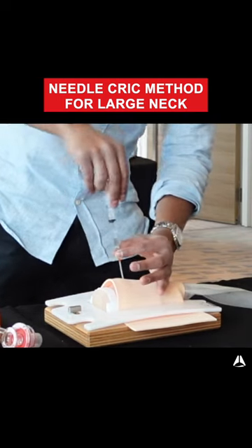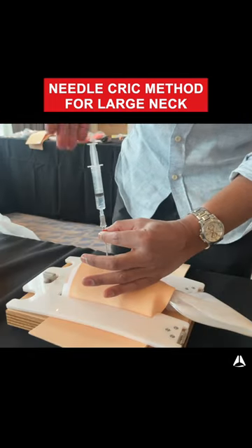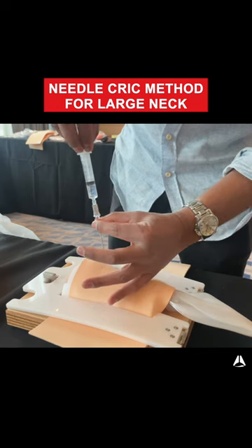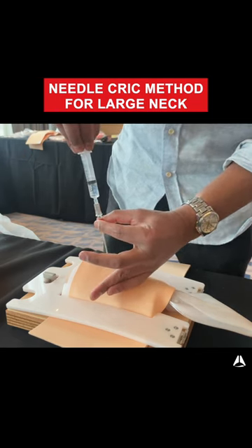Note that I'm not angling the needle. I really want to see exactly where the trachea is — angling is not going to help as I'm going to be going down into a different plane. So I systematically go lateral to the midline to try and find the trachea.